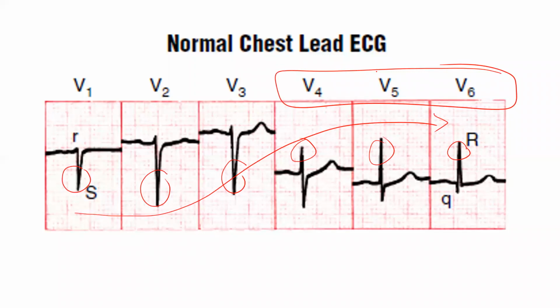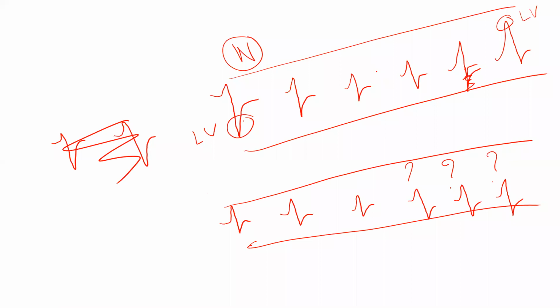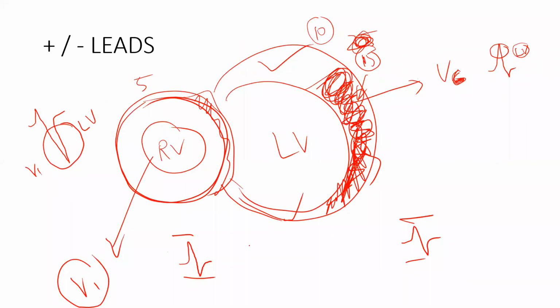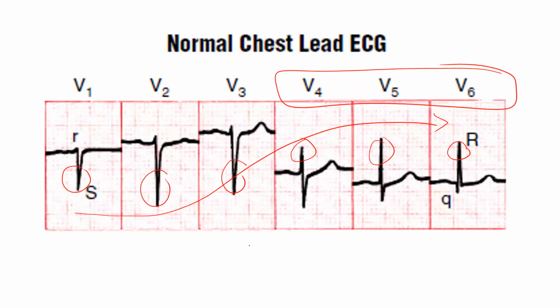So this is how, as I showed you just now in the diagram, so many nice images and all, I told you the progression should occur like this. This is the diagrammatic representation, okay? But the ECG I showed you a few moments back is totally different. That's why I told you it is something like anatomy. The book shows you all the different types of nerves, muscles, different colors, everything. But when you open up the body in surgery, it will be totally different.